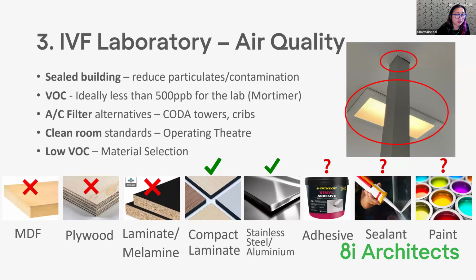The other thing with air quality is, particularly for countries that can't afford to have labs with whole-room air conditioning systems at best practice, you can use things like Coda towers within the spaces, and also cribs. So the IVF cribs now are humidity controlled, temperature controlled, and have HEPA filters that go into the crib as an alternative to making sure that the whole room complies.